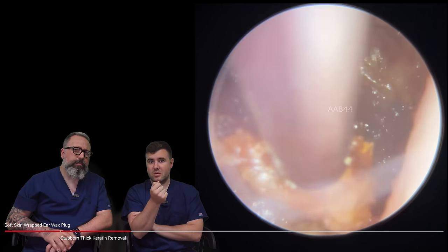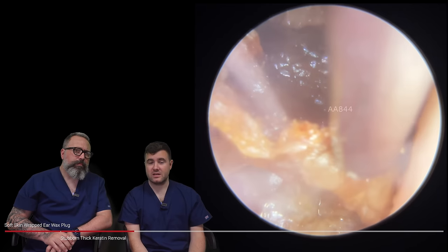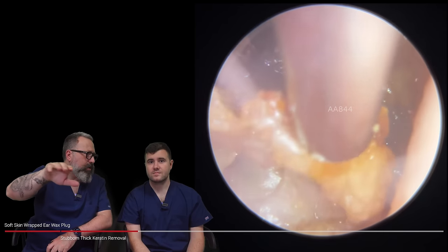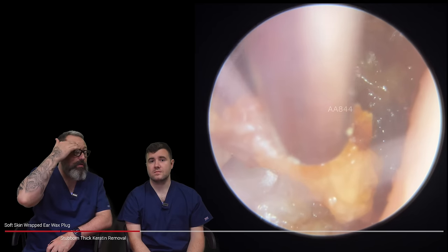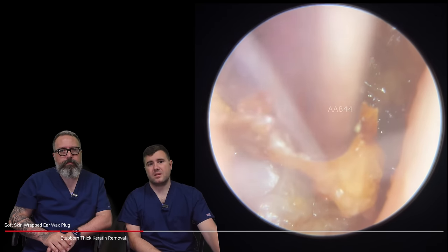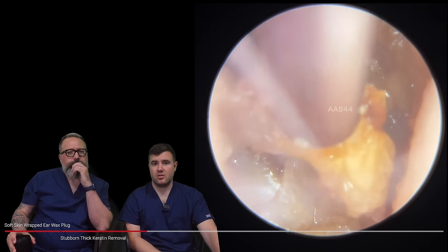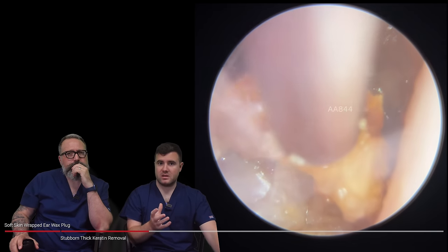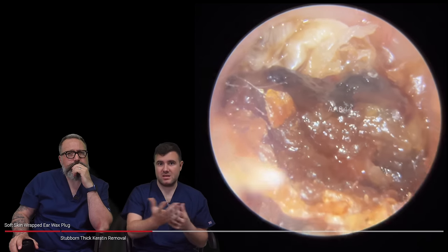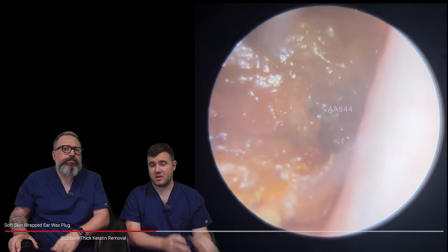It's just not pulling away for us. You can see me gently wiggling back and forward just to try and loosen this piece. You can see with the movement at the bottom, above the suction tube, that whole top section is moving with it — so this is one big piece of skin. The patient had put off getting their ears cleaned for a little while because of their bad experience. The lady had left it literally right up until it was almost not even tolerable anymore. The patient's hearing was almost nothing at all with this being in there.